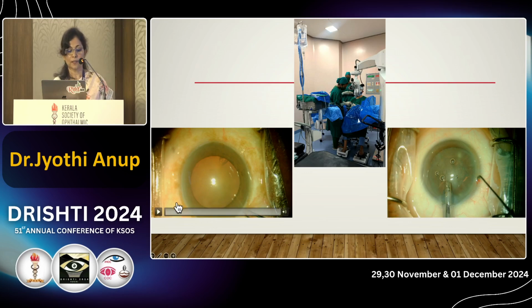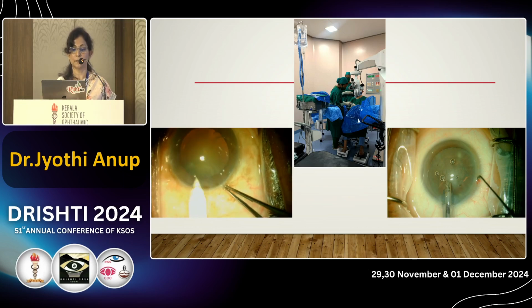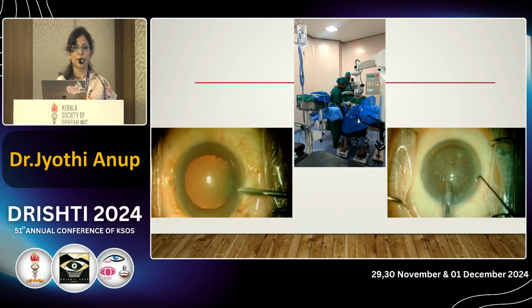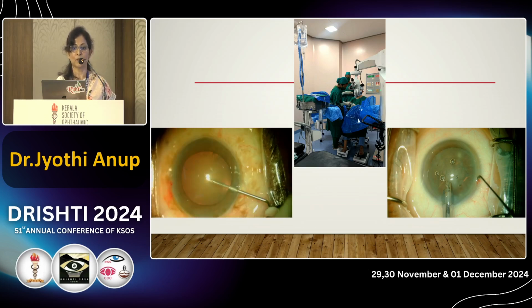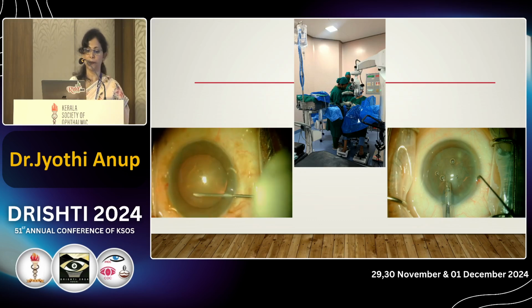And before starting scrubbing, you should go into the OT, adjust your chair, microscope and foot pedals. I am telling you, sitting on a chair with wheels with all 4 of your limbs engaged and doing a tough surgery is no fun. You have to have some time to do it.